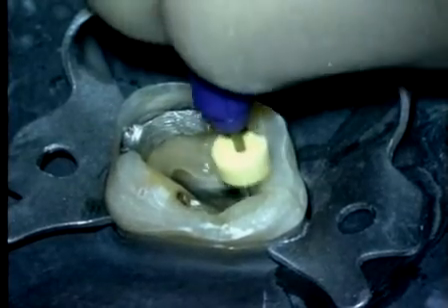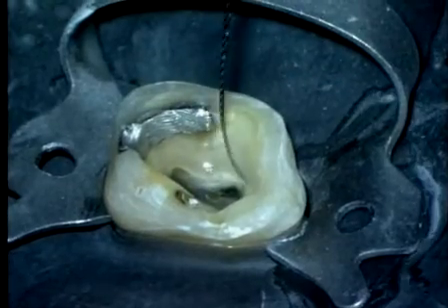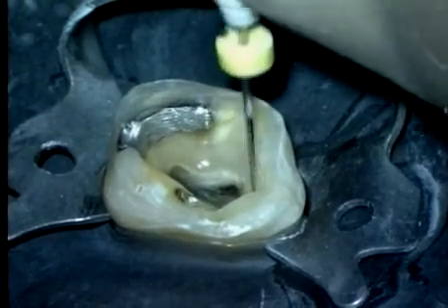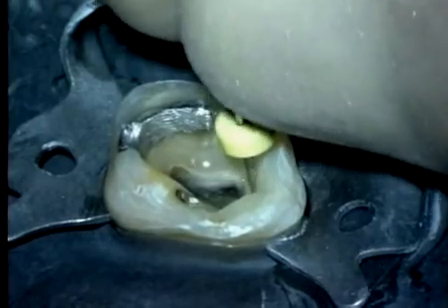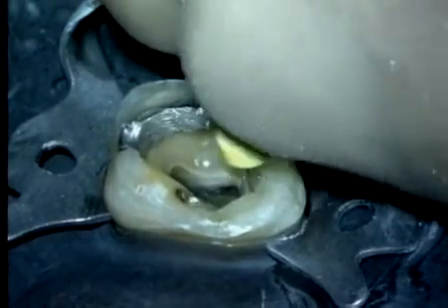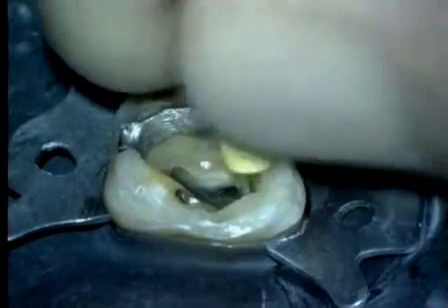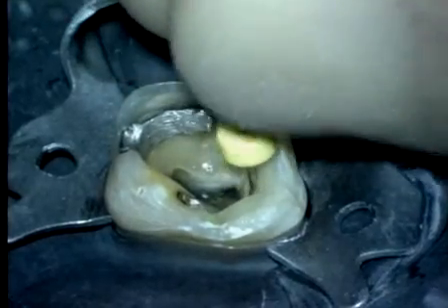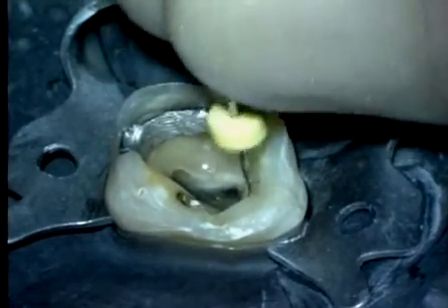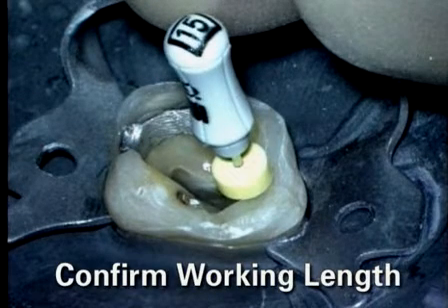Check the glide path by taking progressively longer strokes. The Precurve 15 file follows the use of the 10. Its handle is gently reciprocated in a back and forth watch-winding motion. This will typically pull it into the canal so it can achieve length. In a pre-enlarged canal, we've made a more direct path to the terminus, so at this point we should be thinking about checking our working length.